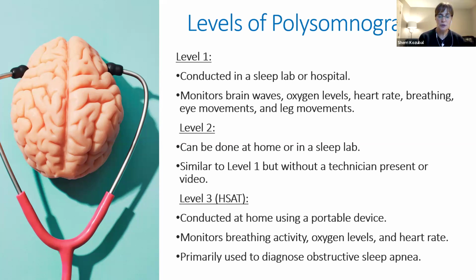The level 2 study is done at home or in a sleep lab in some circumstances, and it's very similar to level 1, but there's no technician present or video.